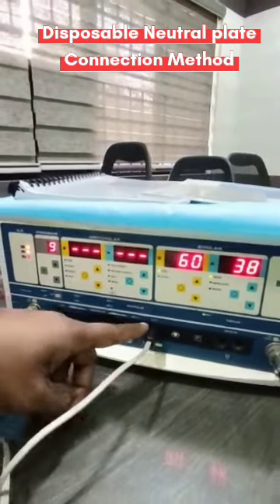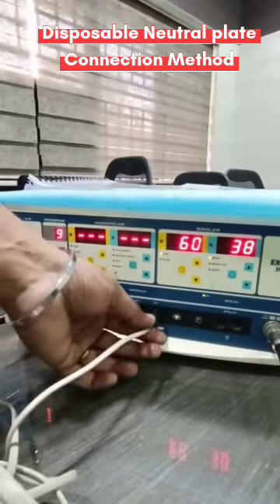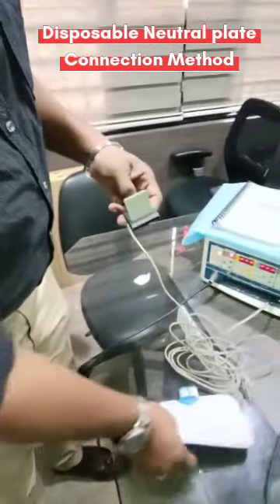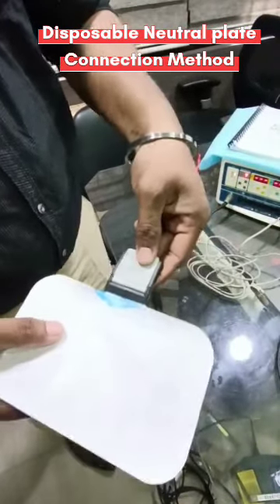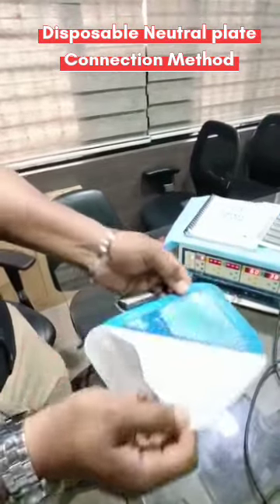This connector will go into the machine's neutral plate socket — also called earth plate or patient plate socket. You fix this connector into the machine, and this other end is used to connect to the patient plate. Just open this cap, put it inside, and lock it so it gets locked.